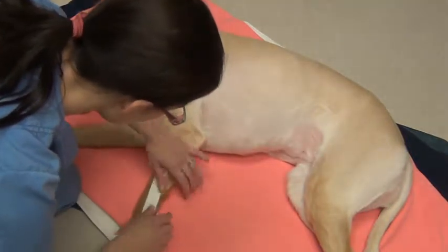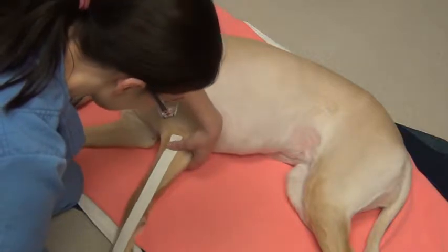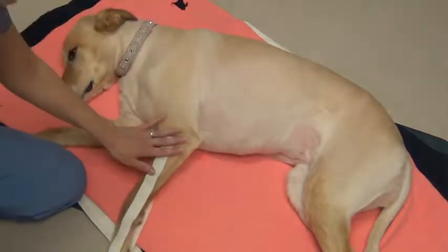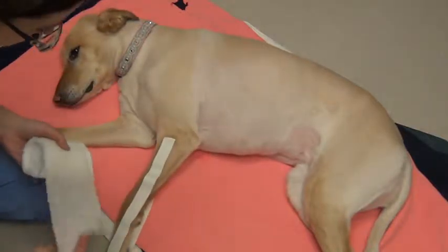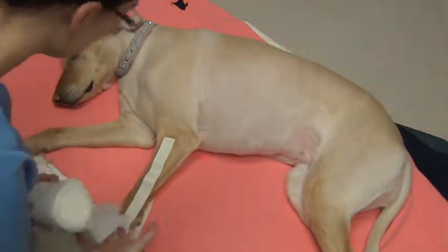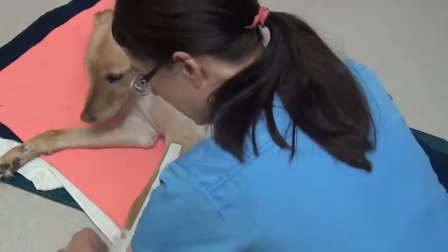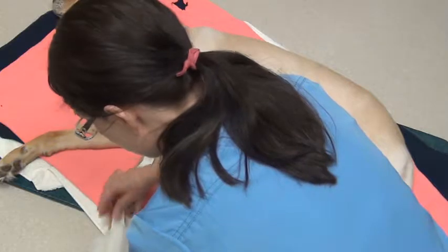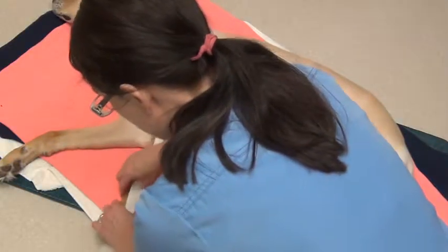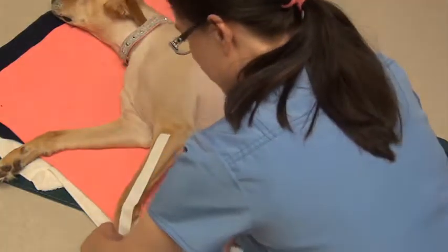Okay, that part is secured, so we've got our stirrups ready. I've got a piece of tape on the lateral and medial aspect of the leg. So we're going to start using our cast padding to create our nice fluffy surface on the leg. I'm going to start at the distal end of the limb, and I'm going to make sure that I leave my toes out. We don't want to wrap our toes up in there, because if we do, we're going to hide any evidence of any swelling that we caused by improperly putting the bandage on.